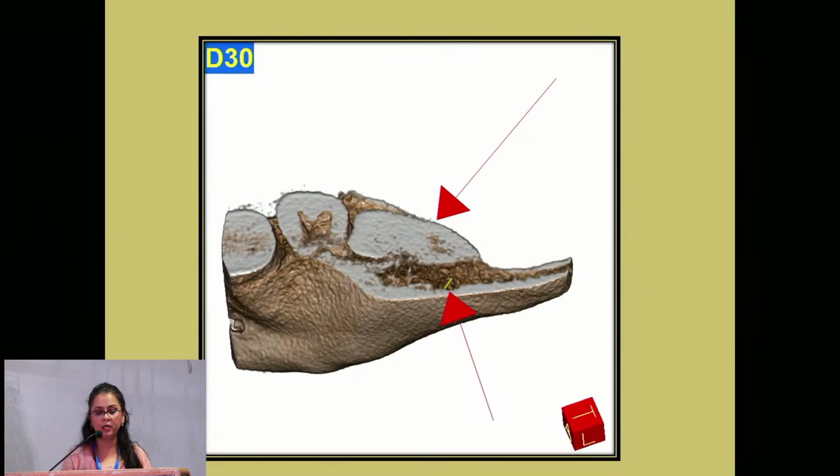So this is actually the buccal side where you see the mental foramen. The tooth is placed very lingually. You have a very thin lingual cortical plate here. The chances of fracture of the lingual cortical plate is obvious. And here, in the yellow mark, you can see that there is an inferior alveolar canal, which I am showing you here. So this is how you give a good indication to the oral surgeon or your operating clinician.